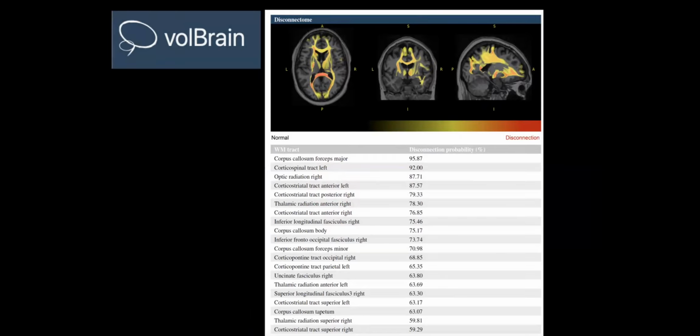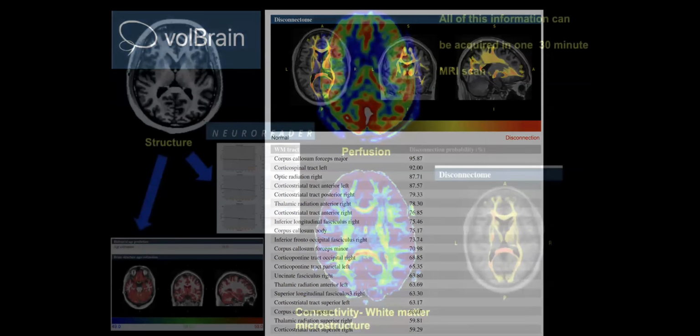And so this is another individual who had a traumatic brain injury where we can see multiple areas of the brain with high probabilities of disconnection in major white matter tracts, including the cortical spinal tract, which is important for movement, the optic radiation, which is important for vision, the corpus callosum body, which we know is affected by traumatic brain injury, and the corpus callosum tapetum, also affected in traumatic brain injury. And so again, this is important to know because this can also be a more sensitive way of tracking potential functional consequences clinically, as well as the overall burden of abnormalities in the brain related to traumatic brain injury.